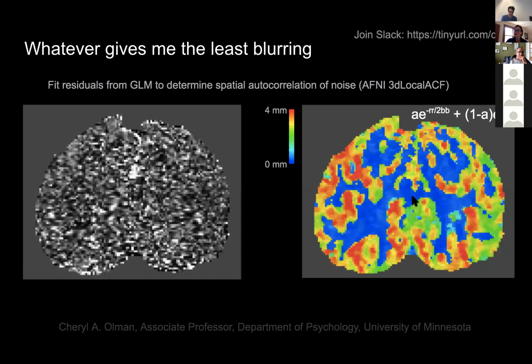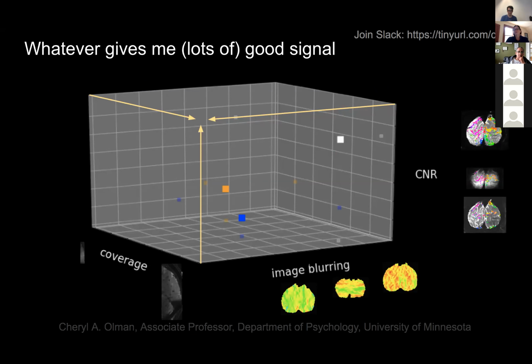This third parameter, I'm not talking about it today, but it's kind of an eye-popping map. This is the distribution of the C parameter, which describes the long tail of the probably physiological noise correlations in my data. And the way it just nicely maps onto gray matter and white matter reinforces the idea that it's physiological. And then I'll see these voxels that have hugely long spatial correlations that look suspiciously like the locations of large vessels.